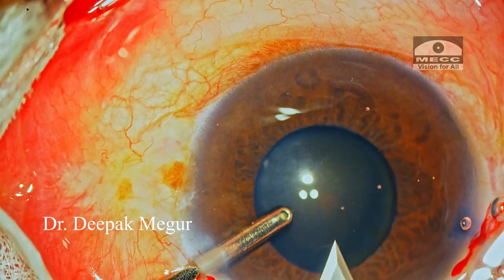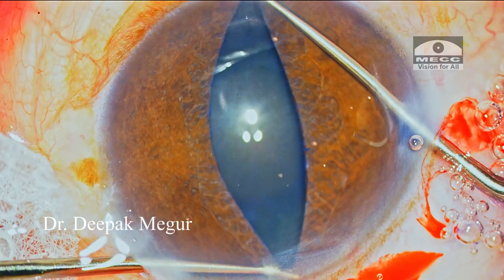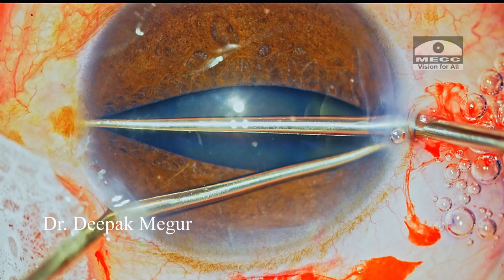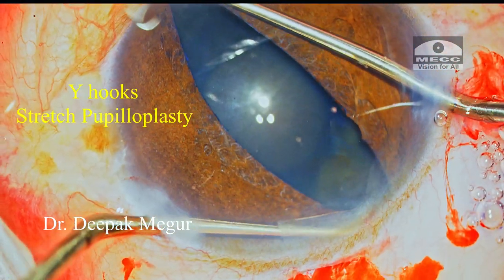During the surgery, I will highlight certain crucial moments and tips which have a bearing on how the surgery would proceed. After the main incision is created and the chamber is filled with dispersive OVD, Y-hooks are used to perform stretch pupilloplasty before using the B-hex ring.